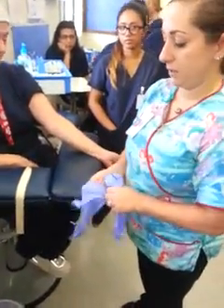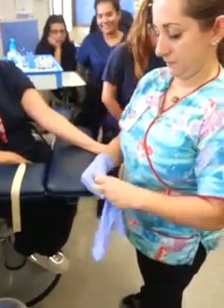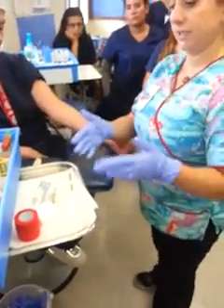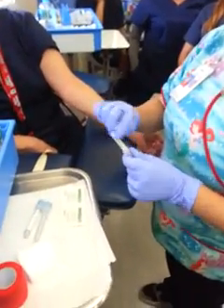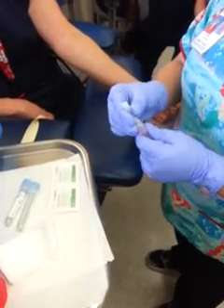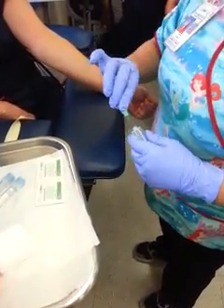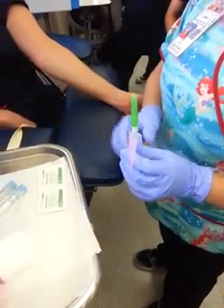Then you're going to put your gloves on. Make sure that everything is accessible to you. Remove the clear plastic portion of the needle where you will see the rubber sleeve over the needle. You can go ahead and assemble it now — that's fine — and then just put your safety back.